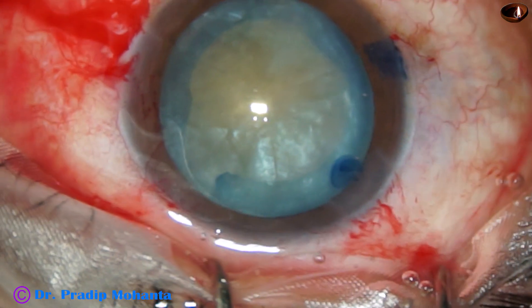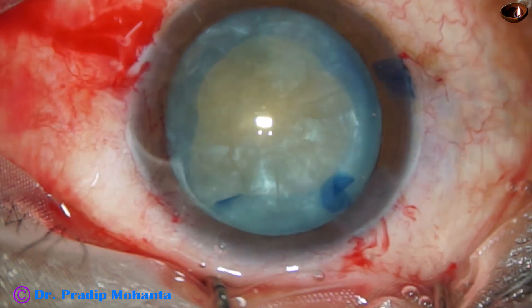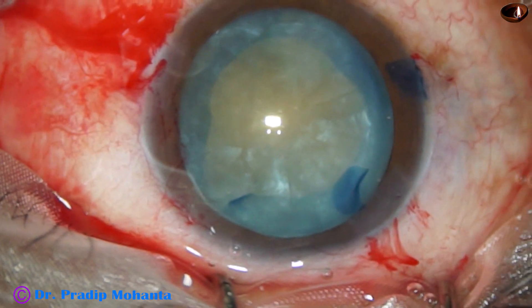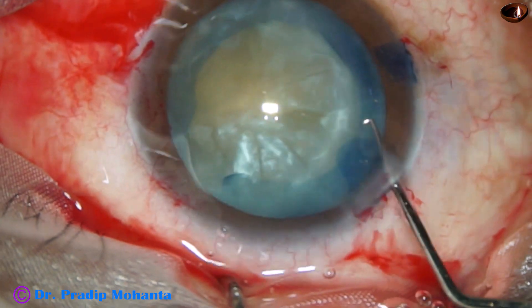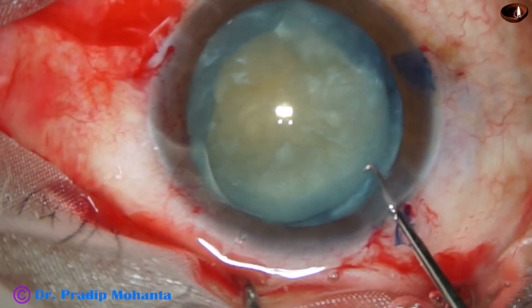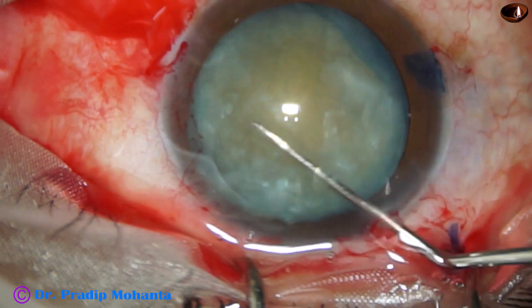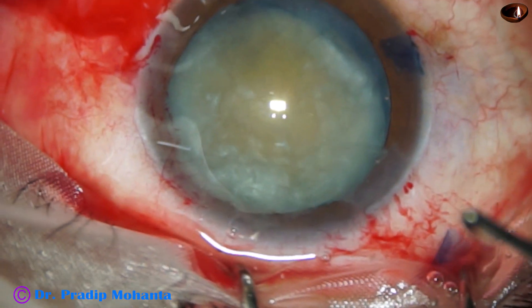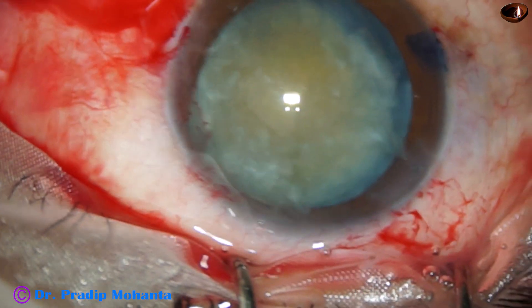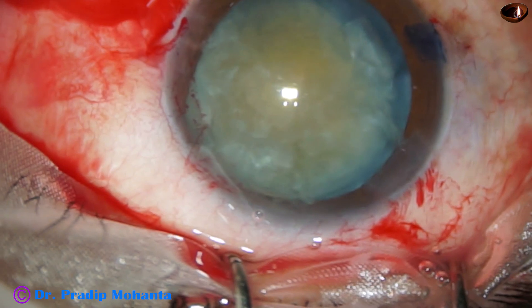My plan now is to prolapse the nucleus into the anterior chamber and bring it out of the capsular bag. I take a Sinski hook and dial the lens — the nucleus comes out and I place it at the iris plane. I then inject viscoelastic.